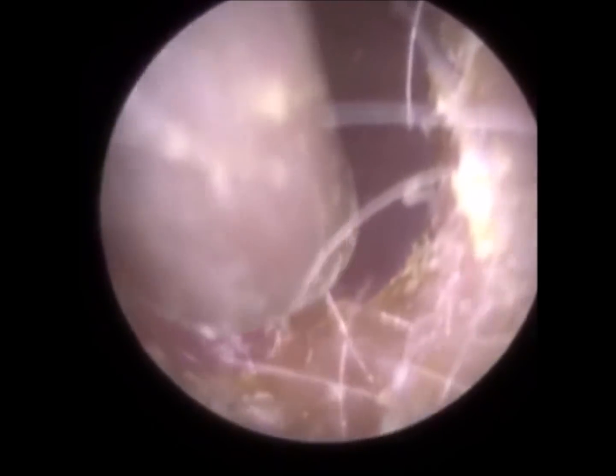So I've just gone back in with the Zollner suction probe, the 2mm, the larger one, and here we're just making contact with the canal wall. It's fine. It's not uncomfortable for the patient. You can see the hairs there, so that means we're in the outer part. So these hairs grow in the first centimetre of the ear canal roughly. That's where all the hair follicles are. You don't often see hair deeper in the ear.